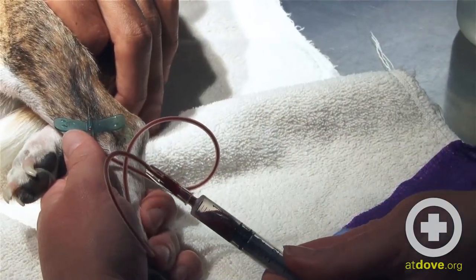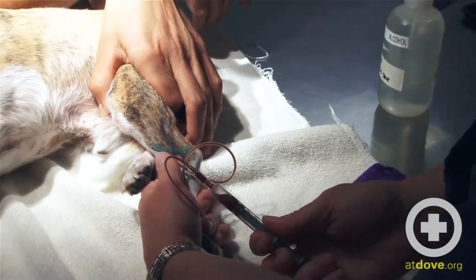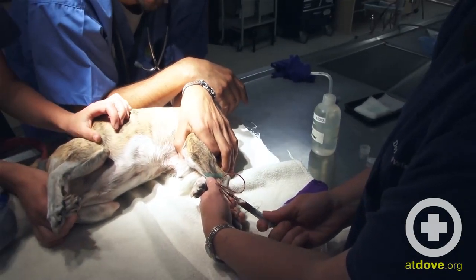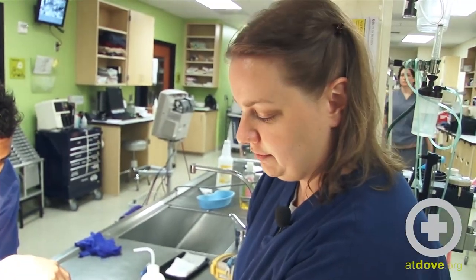This also works well on large patients. If their limbs are cold or they have a really low blood pressure and you're having a hard time getting a sample, I will often move to a butterfly. I do like to use the butterfly catheter in cats. If I need a sample larger than one ml of blood, I will almost always go to the butterfly catheter.